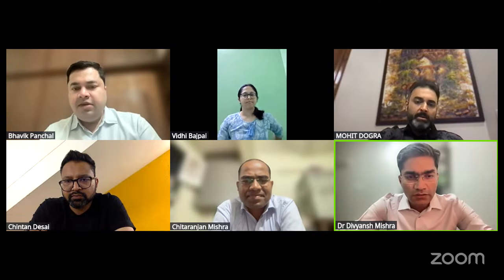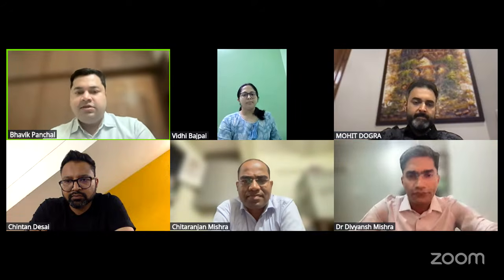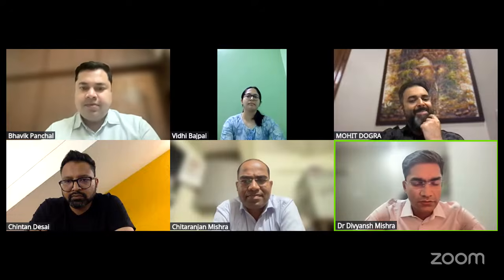See, I would say the kind of hole which we are looking at, I think peel, no peel, peel, only temporal peel, peel. Dr. Divyansh, can you be a little louder? I am not sure if others also feel the same. Okay, you are able to hear me now? Yeah, little better, but if still you can just speak a little louder. Okay, so the question is which is better?